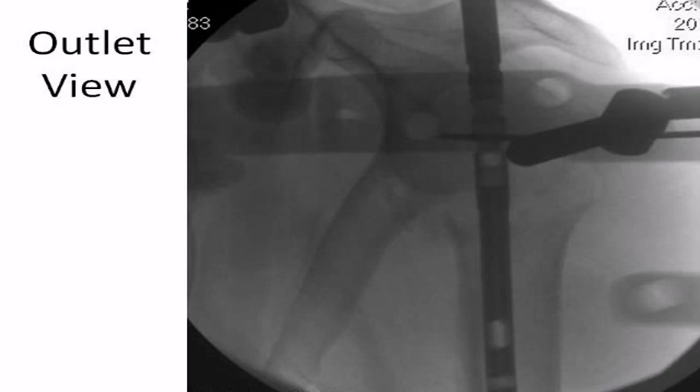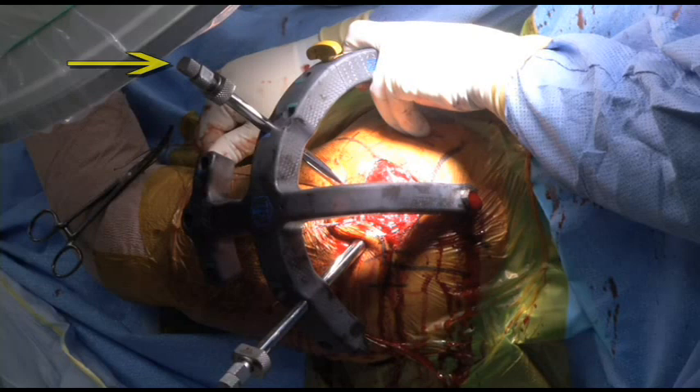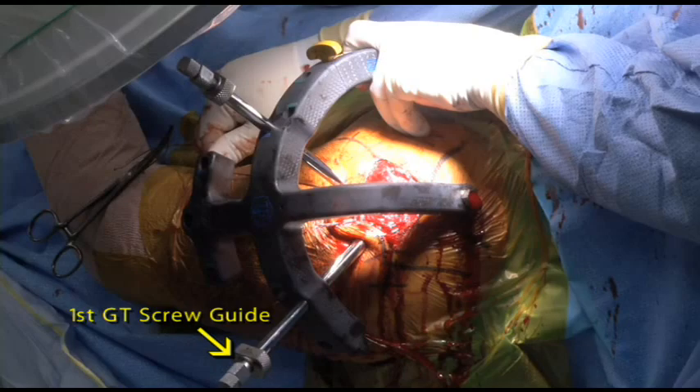The outlet view is used to visualize the placement of the first greater tuberosity drill and screw guide. In this case, the nail is rotated slightly internally to maximize purchase of the first screw in the greater tuberosity. Two drill sleeves are in place: the first in the fourth screw hole and the second in the first screw hole in the proximal jig. The fourth screw hole sleeve gives the surgeon a rough idea of the anatomic rotation of the nail. If the fourth screw hole sleeve appears to be aligned at about 30 to 40 degrees of retroversion in relation to the forearm, the nail rotation is correct, simulating the anatomic version of approximately 30 to 40 degrees of retroversion of the humeral head. The lower drill guide is for the first greater tuberosity screw.